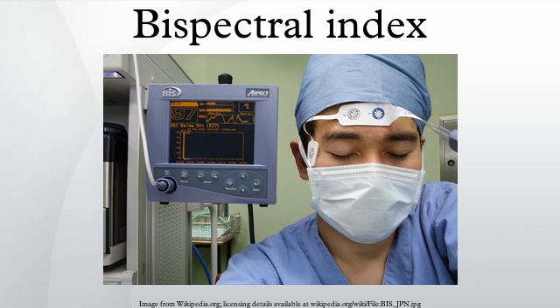A Cochrane review in 2014 found that 4 studies that used clinical signs as a guide to anesthetic administration in standard practice, as the control group, demonstrated a significant reduction in the risk of awareness with BIS monitoring. 4 studies compared BIS monitoring with end-tidal anesthetic gas monitoring as a guide to management of anesthesia, and they did not demonstrate any difference in terms of intraoperative awareness.